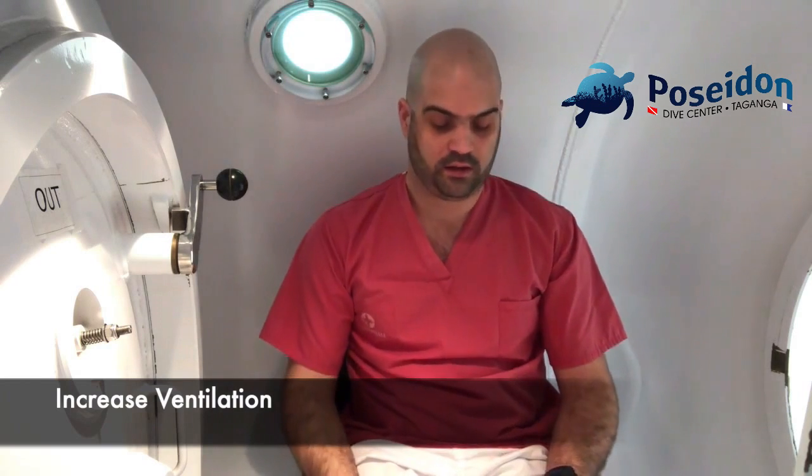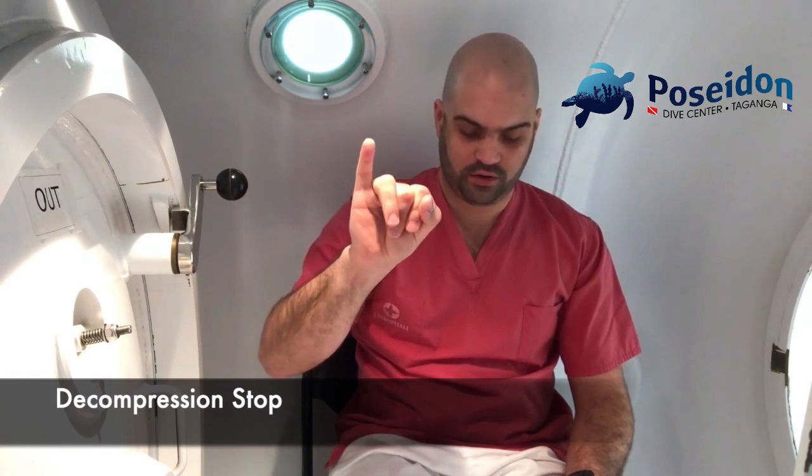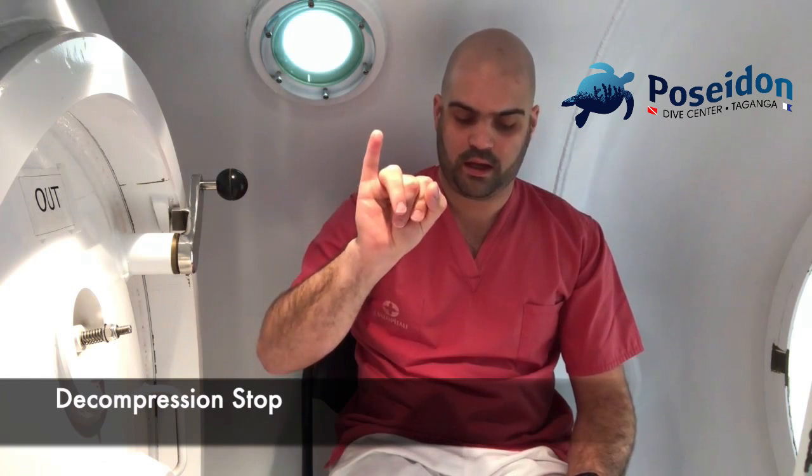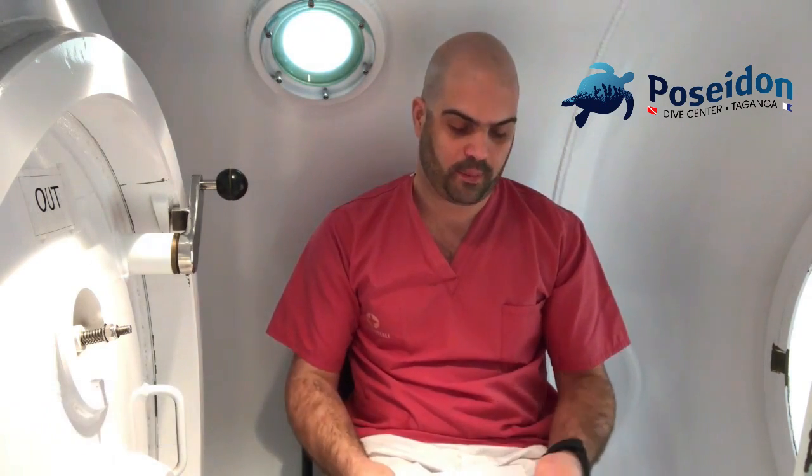If the temperature in the chamber is hot or you need to change the air or increase the ventilation rate, then we have a signal like this, okay? You just do circle movements like this, and that will mean that you need to increase the ventilation. If you want to refer to any decompression stop, we talk like this, and we are also using this signal to ask how much time is left in the decompression, okay? This is something specific for the operation in this service.